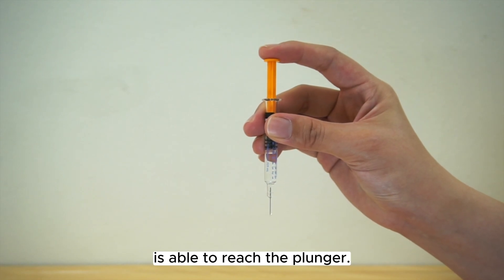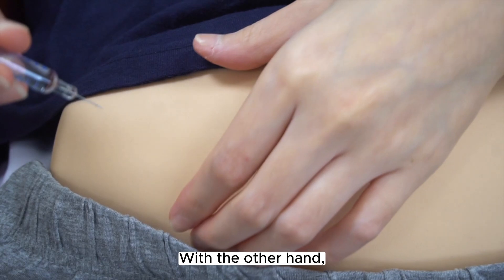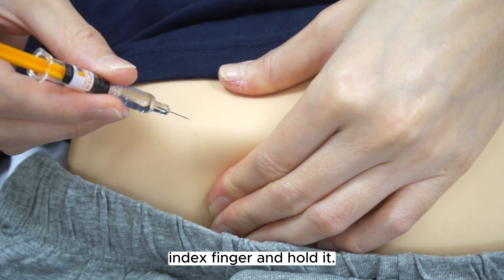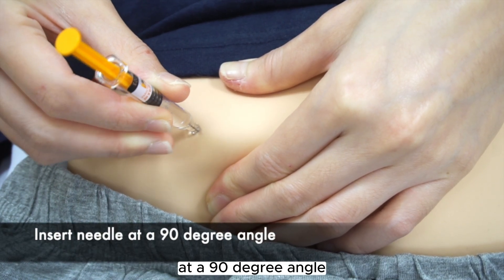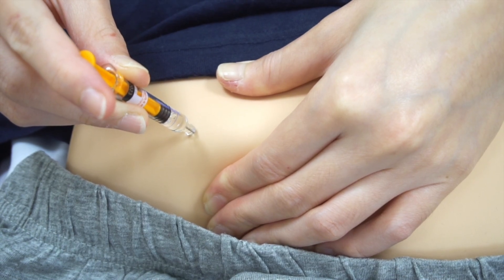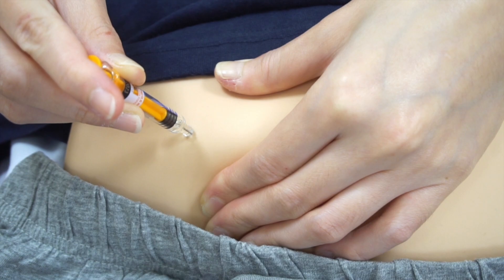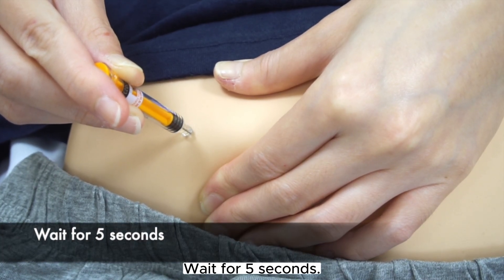Ensure that your index finger is able to reach the plunger. With the other hand, gently pinch the skin with your thumb and index finger and hold it. Insert the needle into the pinched skin at a 90-degree angle and slowly press the plunger with your index finger to inject all the medication. Wait for 5 seconds.